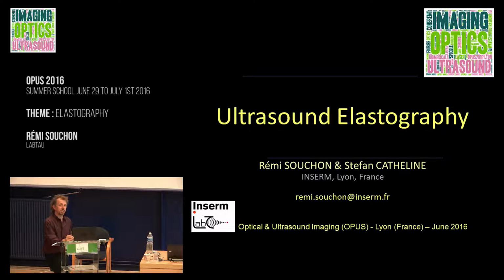And the reason is the resolution cell size of ultrasound, because it's very good in the axial direction, but not as good in the lateral direction. We have images with a very sharp profile in axial, so we can track very nicely, but it's really flat in the lateral. And if it moves a little bit, it's hard to know, especially when there's noise on top of that. So it's hard to measure.